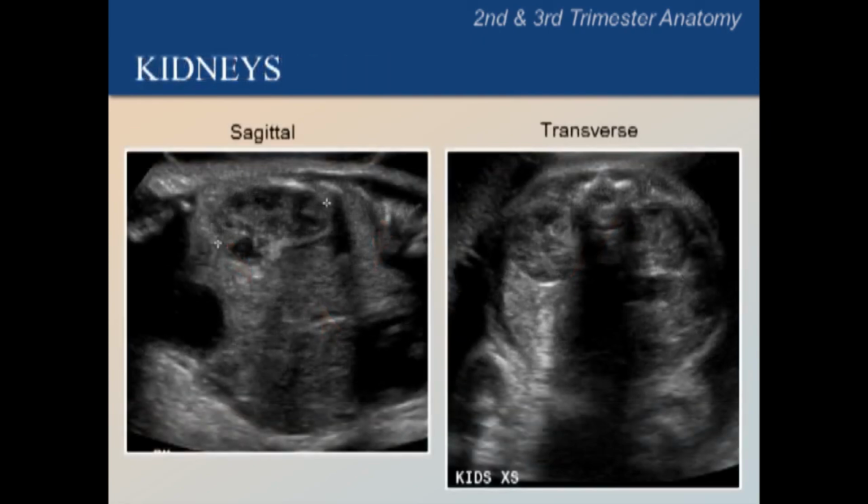Kidneys can be seen in the second and third trimesters. The kidneys are oval-shaped on the sagittal view, and we have outlined a kidney to make it more visible. On the right image, the kidneys appear more rounded on a cross-sectional or transverse view. On this transverse image, you can see both fetal kidneys. Now, we remove the outlines to allow you to find the kidneys again.